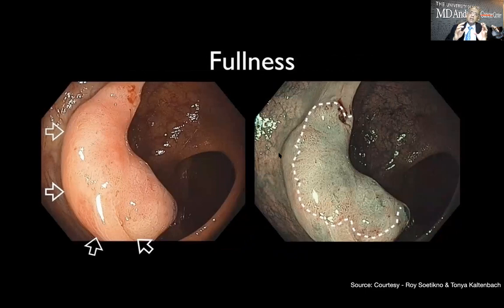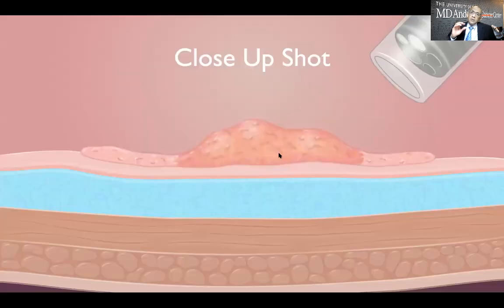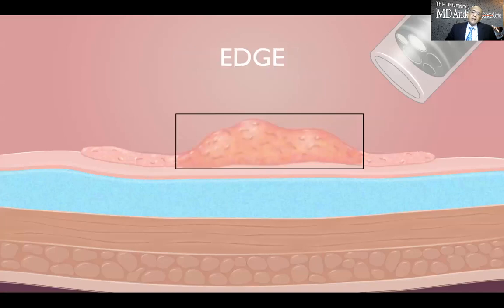So when you see a lesion from a distance, you should ask yourself whether there is cancer or not. And if you think there is cancer, you're leaning more towards surgery. On the other hand, if you do not have any of these features of cancer, then you're spending your time to go a little bit closer and take a close-up shot.